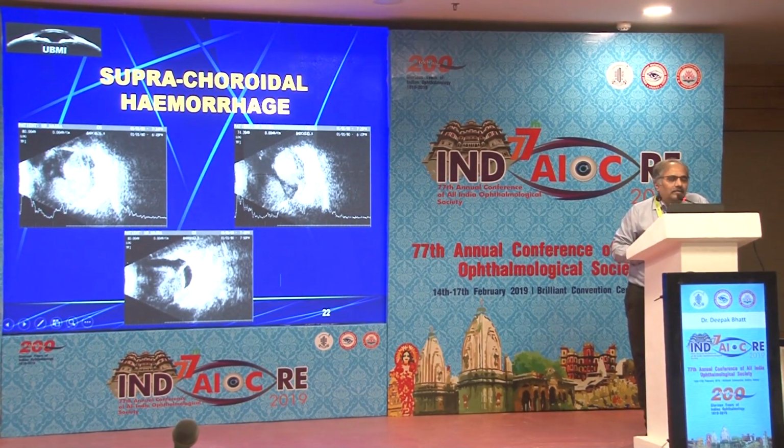He had a tumor, a prostate removed about 10 years back, but otherwise he was absolutely fine. It looked like a lobulated lesion to me on day 1. You know, the optic nerve was somewhere here, and this looked like a lobulated mass. Even I said it is a choroidal metastasis. So he decided that he's 80 years old and not going to get any treatment. He went to his village, just went away.